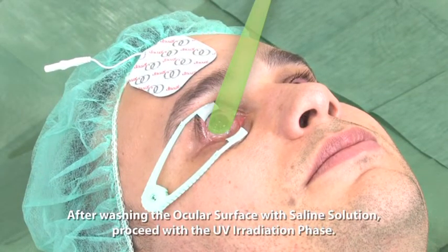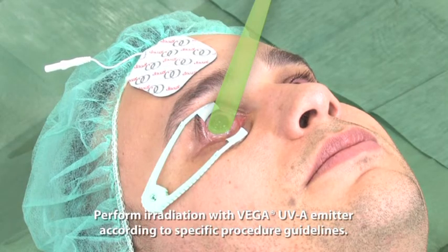After washing the ocular surface with saline solution, proceed with the UV radiation phase. Perform irradiation with the Vega UVA emitter according to specific procedure guidelines.